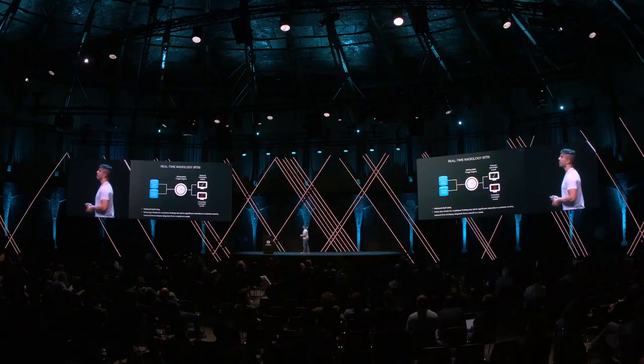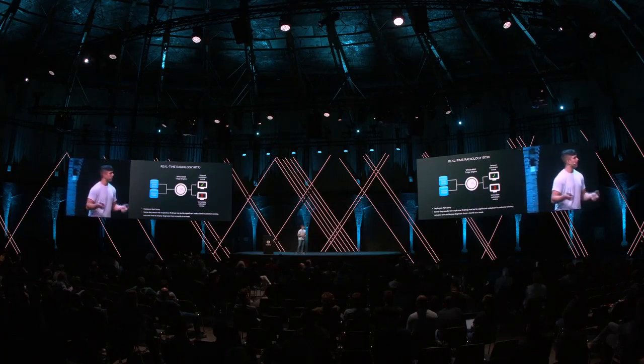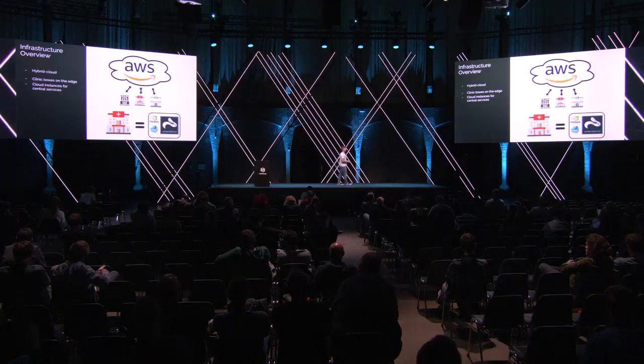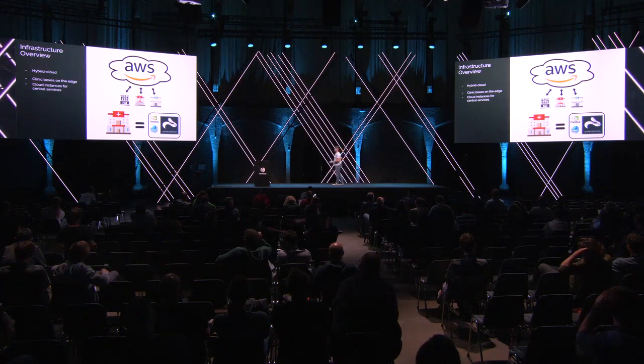As of right now, the actual software component might be quite nebulous. What is the Whiterabbit triage engine? And most importantly, what system and infrastructure does this actually lie on top of? That's when we get into the infrastructure overview. We'll talk a bit about the underlying systems and what is there. At high level, we have a hybrid cloud, multi-cloud, multi-platform, whatever your preferred term for it is, where we have centralized services on Amazon, but we also have software and hardware we deploy to our clinic sites as well.